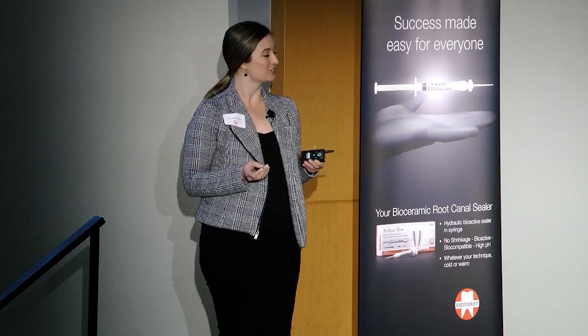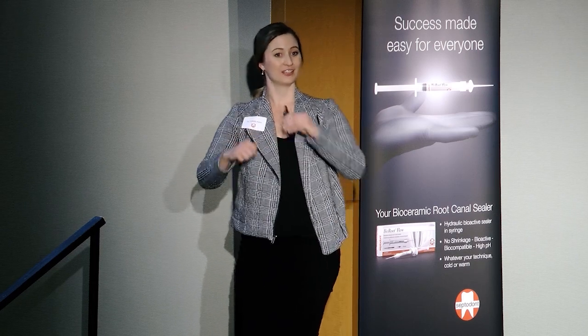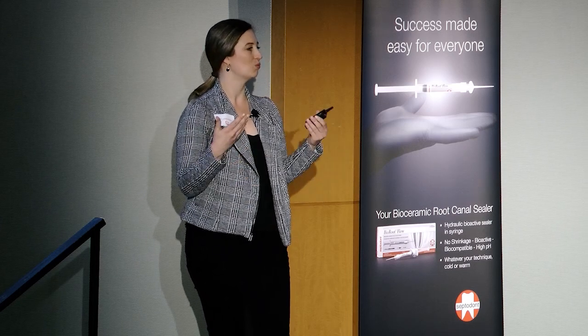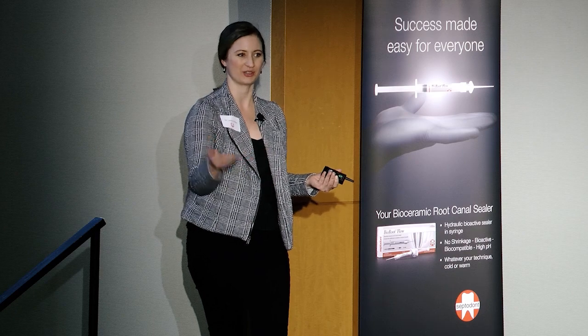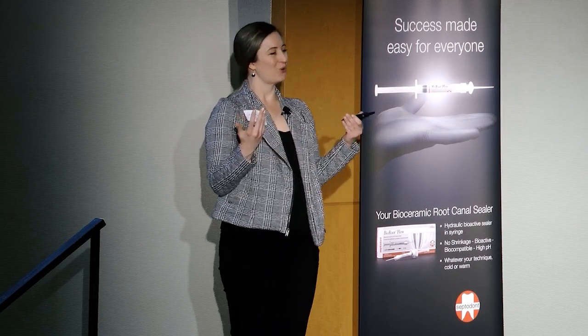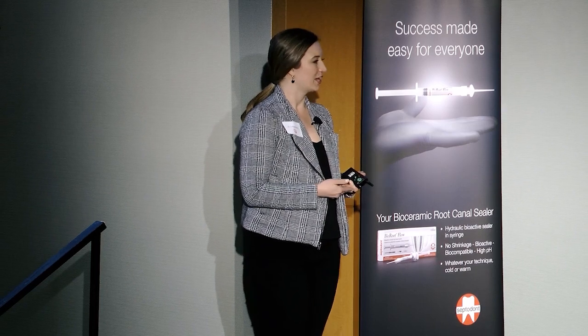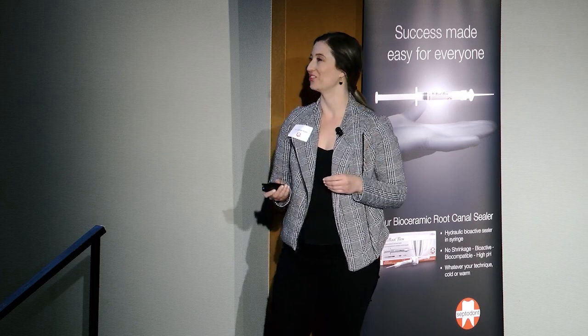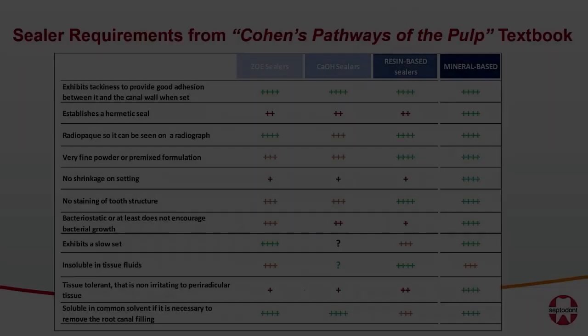It was an interesting scenario, and I had to remind her, please don't put sealer into a syringe and then switch it over to the calcium hydroxide and just tell me it's a white paste. It all worked out. But I do know that these materials, bioceramics, set well. I know this from having to retreat this without gutta percha. So I know that they set well and they are antimicrobial, and that's what we're looking for. We're trying to prevent contamination for our patients, and the best way to do that is to create a tight seal. I can say with a lot of certainty that this product does that.